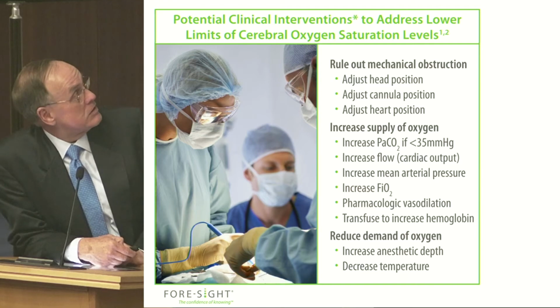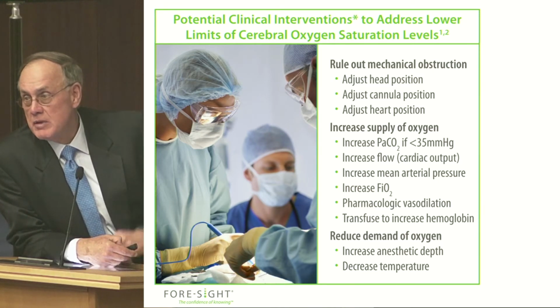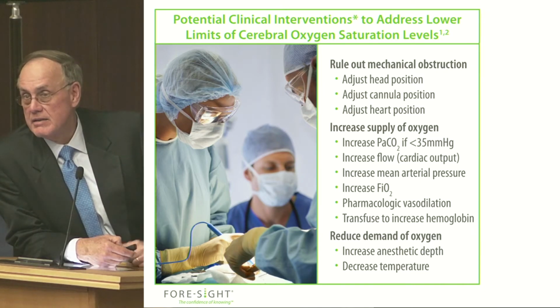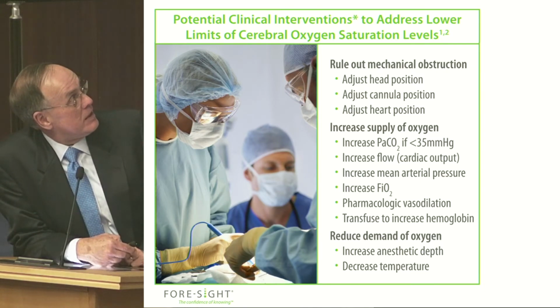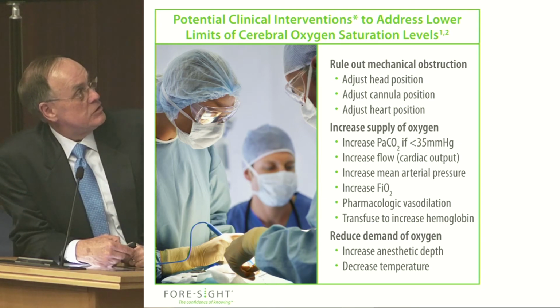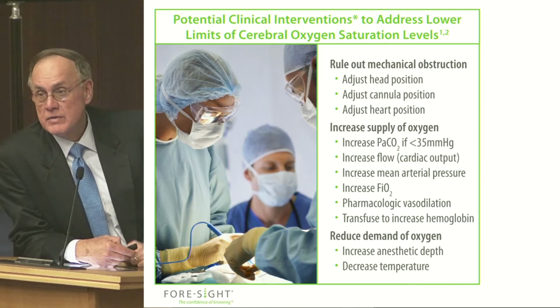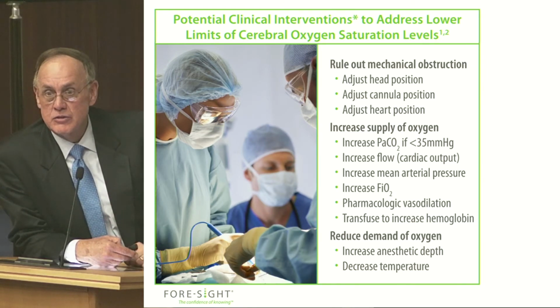Well, the first correction is to make sure that the blood is actually flowing to the head. And you can do that by adjusting the head position. You can adjust the cannula position, or even have the surgeon change the position of the heart.